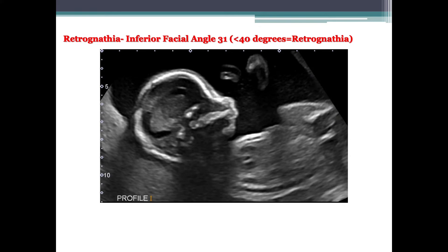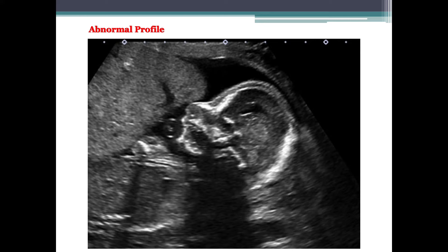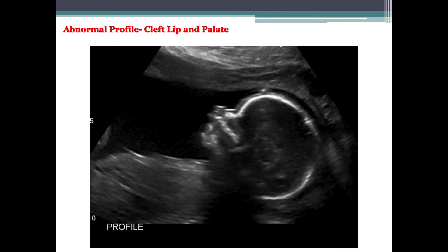Here we have examples of abnormal profiles: one demonstrating retrognathia where the inferior facial angle was only 31 degrees — less than 40 degrees is considered retrognathia. Another example shows a fetus with a significant neural tube defect. And finally, an abnormal profile showing an irregularity to the contour of the face in a fetus with a cleft lip and palate.